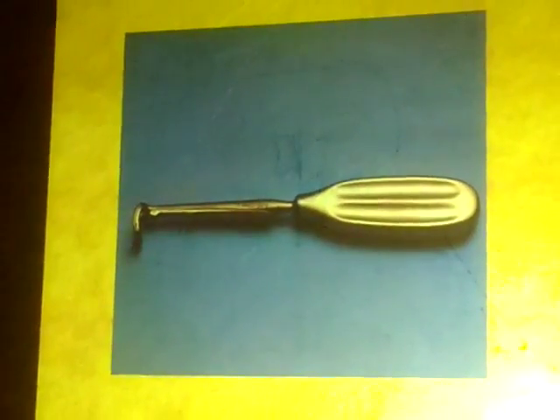So if you're going to curette the adenoid and it slips down into the airway, it's going to be a problem. So this is why the cage was invented, to prevent slipping of the adenoid tissue into the airway. However, this is not a very commonly used instrument these days because it's a little bit bulky and it's cumbersome.